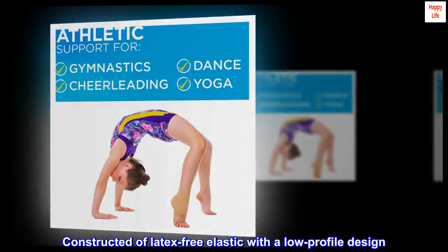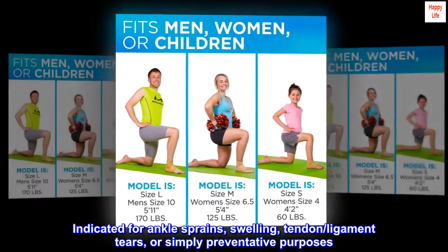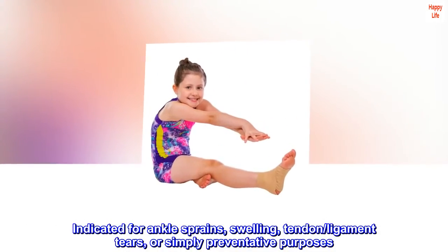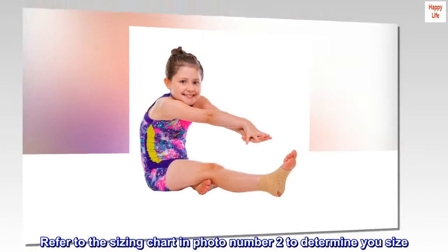Constructed of latex-free elastic with a low-profile design. Can be worn with shoes. Indicated for ankle sprains, swelling, tendon and ligament tears, or simply preventative purposes. Refer to the sizing chart in photo number 2 to determine your size.